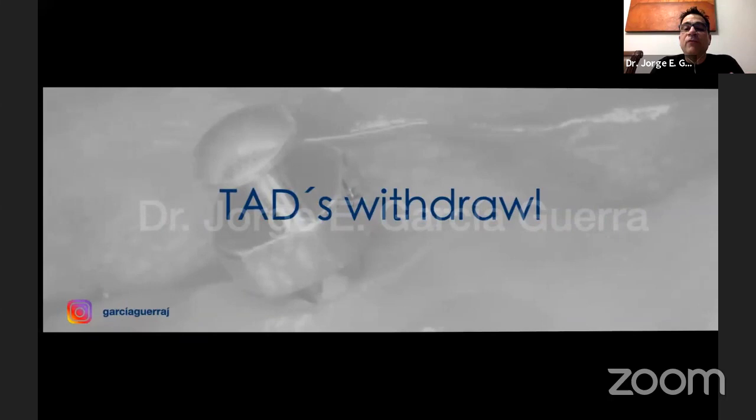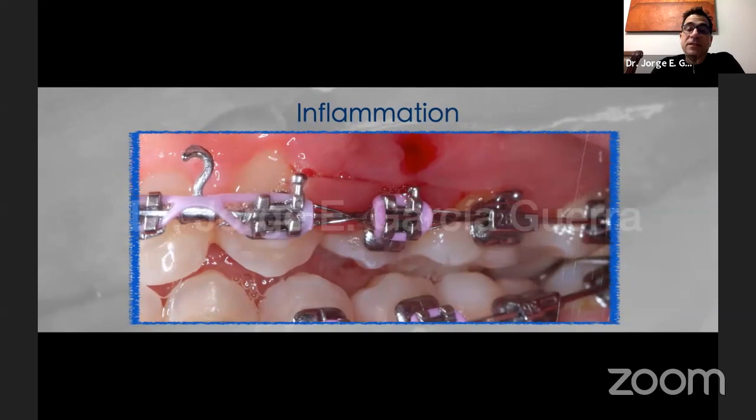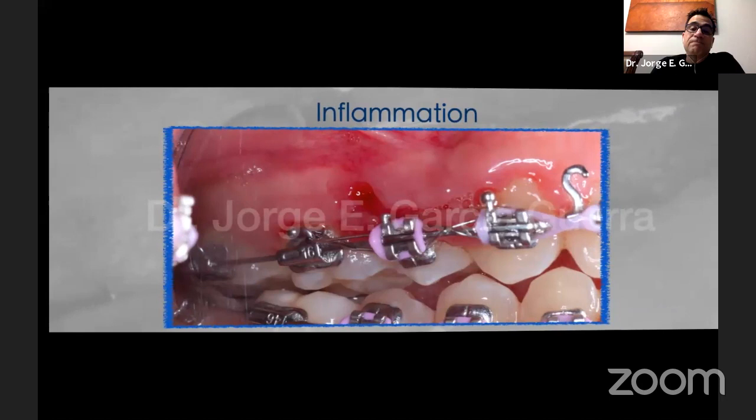Now, these are pictures that we took after taking out the mini implants. Now you can see that the tissue has a lot of inflammation. This also happens if our patients don't have good hygiene. Well, this can happen. And in this case, we had to remove them, and I also took the premolar brackets off so that the soreness or the inflammation diminishes. Okay, see the inflammation in this case. But we can see that the spaces are closing. We have a better space closure there.